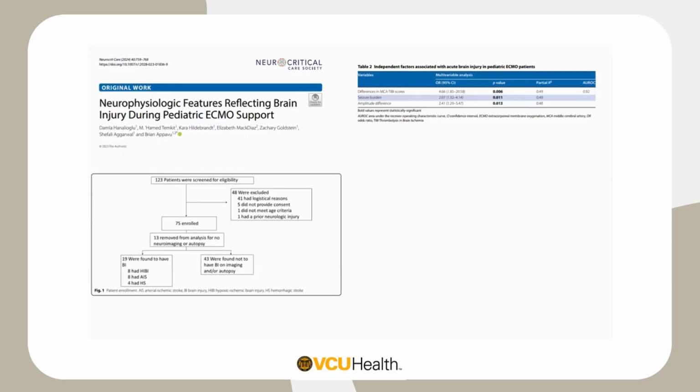As part of this, all patients underwent continuous EEG and continuous NIRS. We used a multimodal monitoring device, the Moberg CNS monitor, to integrate all this data together. And we had all the patients also get daily transcranial Doppler ultrasounds. For the most part, we got them daily, though there were certainly days we missed, and we insonated the middle cerebral arteries.